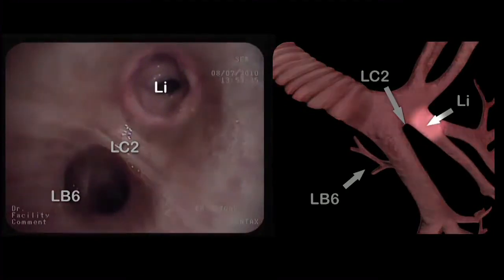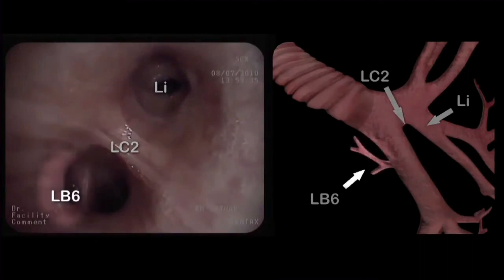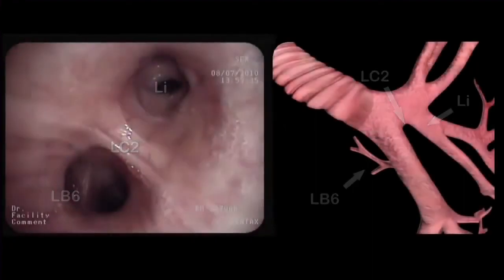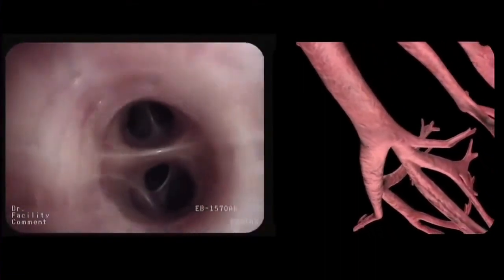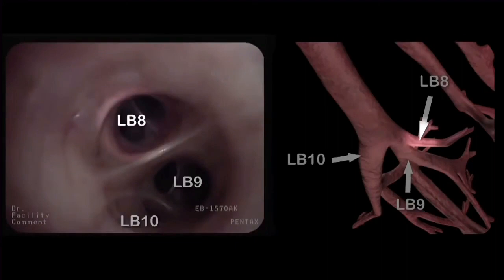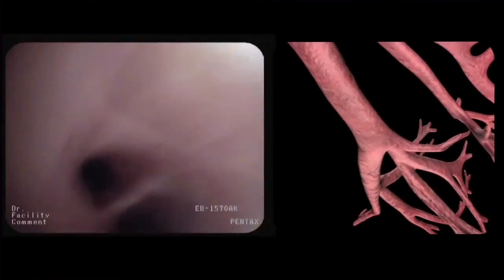At the end of the left main bronchus, we can identify the orifice of the lingula, the left carina II, which separates the upper and lower lobe, and the apical segment or LB6 of the lower lobe. We advance into the lower lobe and first inspect LB6, which immediately divides into three sub-segmental branches: LB6A, LB6B, and LB6C. We retract from LB6 and continue further into the lower lobe, where we identify the anterior basal or LB8, lateral basal or LB9, and posterior basal or LB10 segmental branches. A medial basal branch is usually absent on the left side.